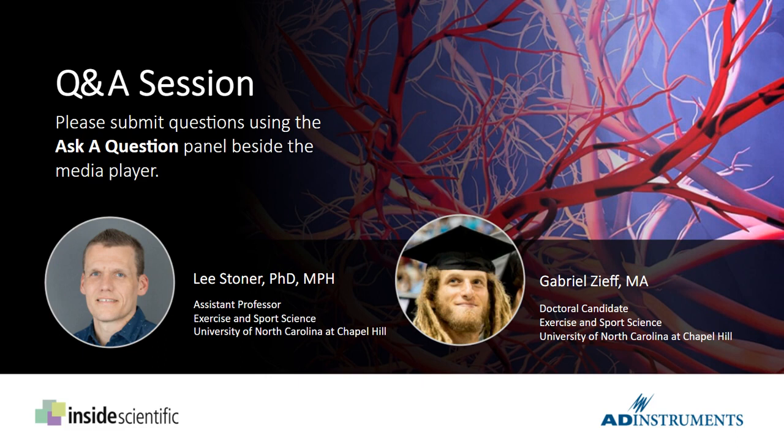Great. Thanks for that. So the next question here is actually for you, Gabe. You showed that pulse wave velocity changed following an orthostatic challenge. Does this mean that blood pressure needs to be taken into account when measuring pulse wave velocity? Yes, that's a great observation. We do know that blood pressure does impact pulse wave velocity. So with that being the case, we do typically recommend that we include MAP, or mean arterial pressure, as a covariate when we are doing our analysis. We also want to be mindful of any medications that could alter blood pressure, as well as body position, which could also impact blood pressure, as we saw with the example of sitting. So yeah, great question.